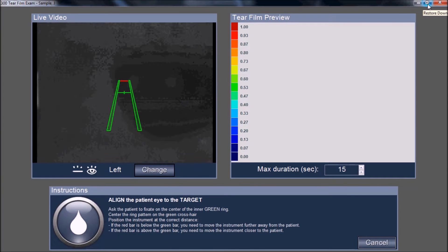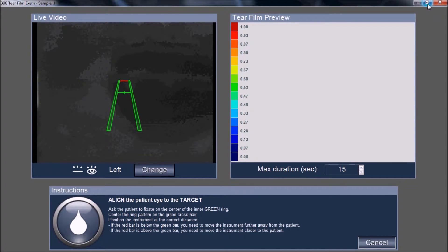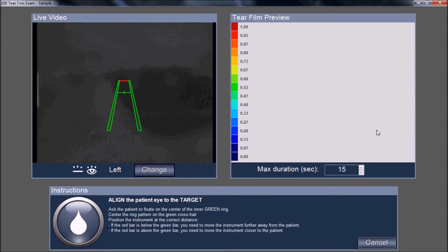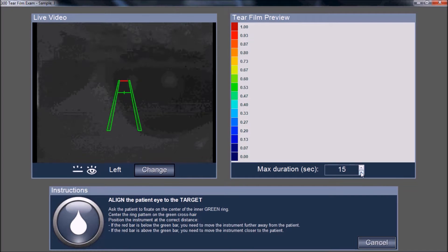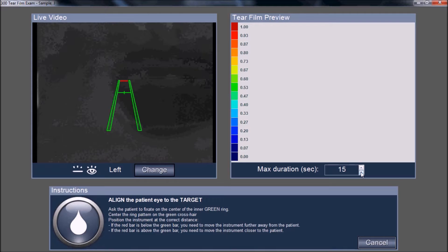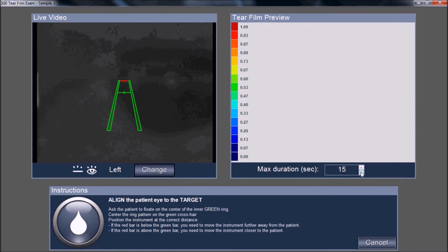With the tear film analysis window open, follow the instructions at the bottom of the screen. You can also select the duration and time over which you would like to capture images. In this case, we've selected a maximum duration of 15 seconds of video analysis.